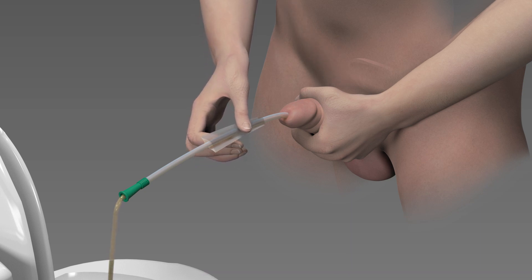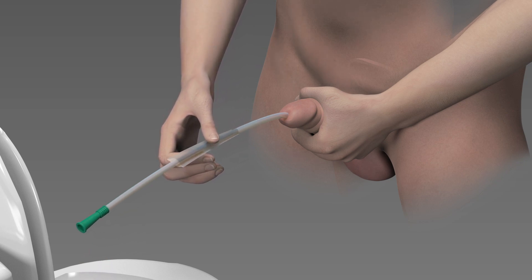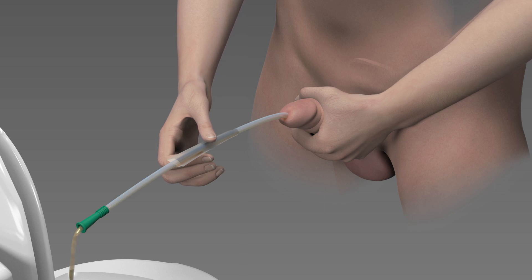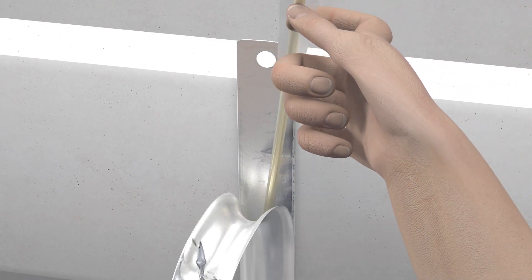Once urine stops flowing, begin to slowly remove the catheter. Slowly rotate the catheter while removing it and stop every time urine begins to flow again. Make sure to check the color, odor, and clarity of the urine. Report any changes to your healthcare professional. Finish removing your catheter, then dispose of it and its packaging.